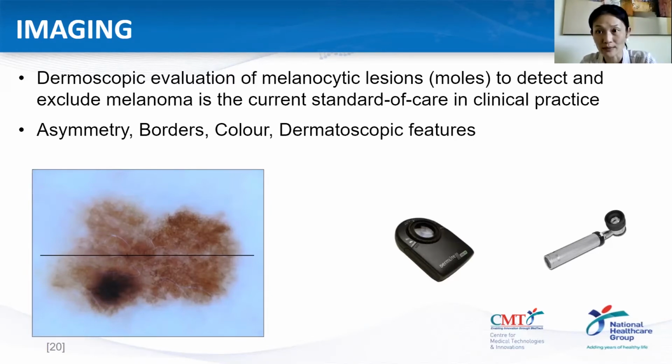high or low risk. So normally for the dermatologist, you have to be very experienced in order to do this quickly, and you have to do it very often. So a lot of the junior dermatologists, of course, lack experience. We all have a dermatoscope, but not all of us know how to read the images accurately. And of course, our friends in the family care, first line, even friends in the hospital, if they want to read, this is almost difficult because they're not trained in skin.